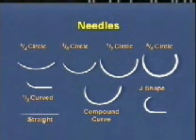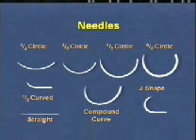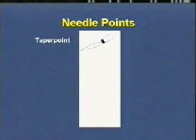The choice of needle shape is frequently governed by the accessibility of the tissue to be sutured, and normally the more confined the operative site, the greater the curvature required. The point profile of round-bodied needles is engineered to provide easy penetration of tissues. A flattened area is provided halfway between the point and the suture attachment. Positioning the needle holder in this area confers extra stability on the needle being held.